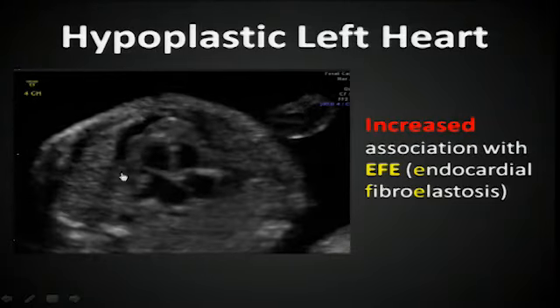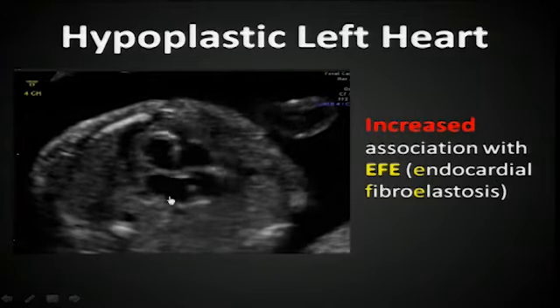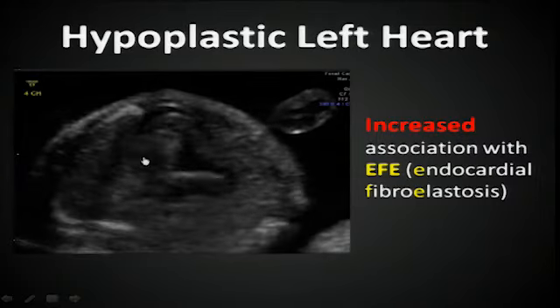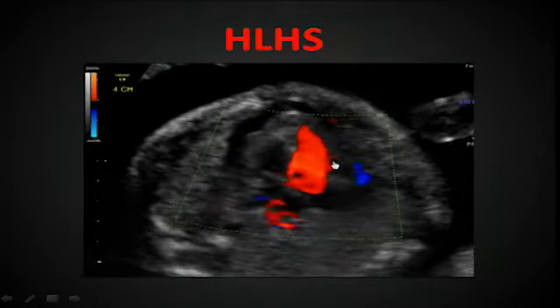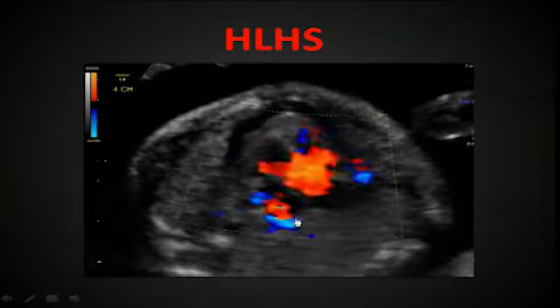That's letting us know that there's been cell death in that myocardium. So left atrium, right atrium. Just look at the difference between the contractility from the right side to the left side. And then just have pericardial effusion. So put color on it. Look at the flow here on the right versus the left.